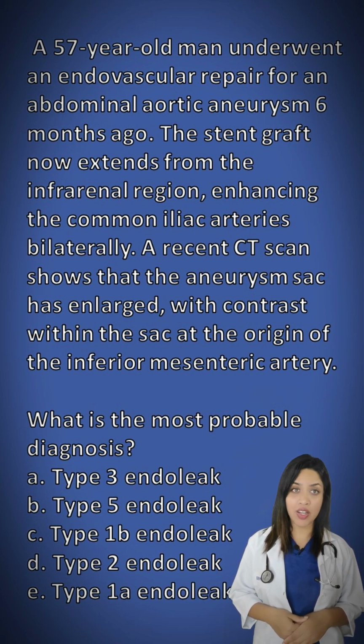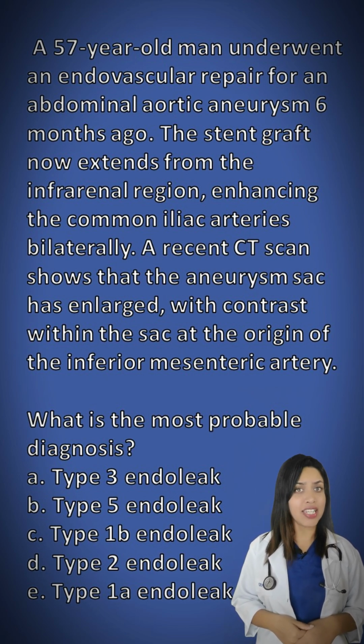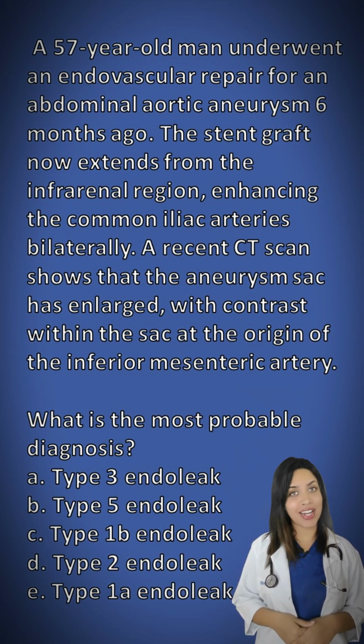Answer A, type 3 endoleak. Answer B, type 5 endoleak. C, type 1B. D, type 2. And E, type 1A endoleak.